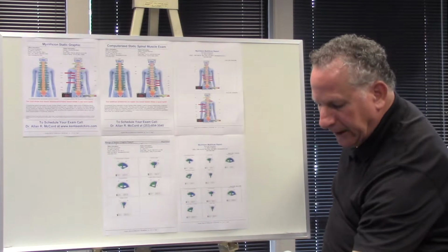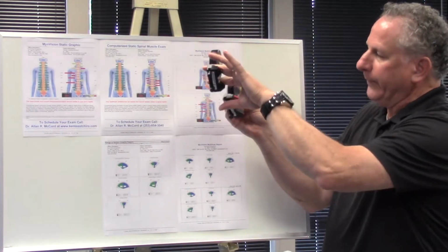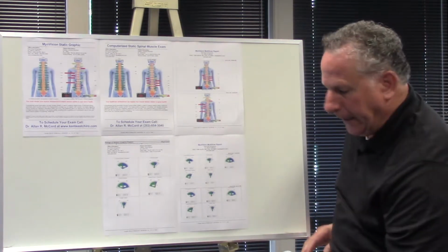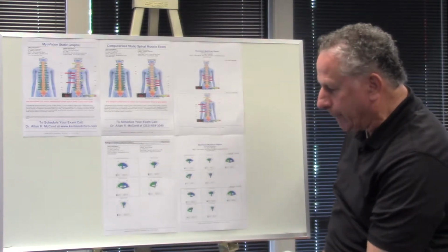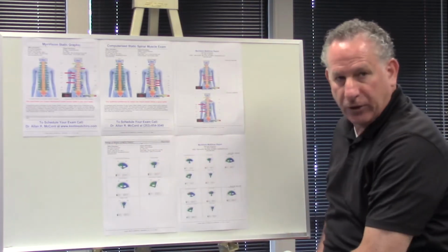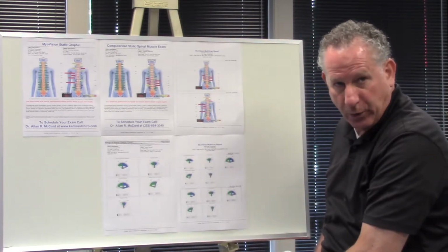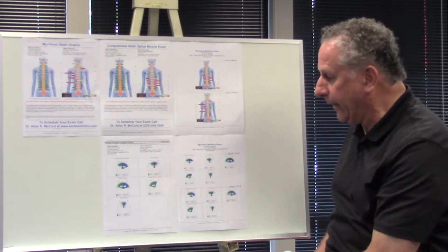Here on these sheets is what we call the range of motion graphic report, and we use these probes that are again tied by Bluetooth to our major control unit. We put these on the head and the back of a patient, ask them to bend, and it records the angles of motion. We have 3 planes of neck motion and 2 of the lower back, and you can see these pie pieces which correlate to the actual degrees of motion that a patient has. There are normals established for each one of those planes, so we can show a patient how their flexibility and mobility is.